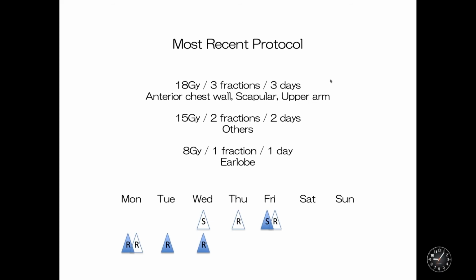For example, if the surgery is performed on Wednesday, the radiation starts on Thursday. And for example, 3 fractions over 3 days, in case the radiation is performed Thursday, Friday, and Monday.